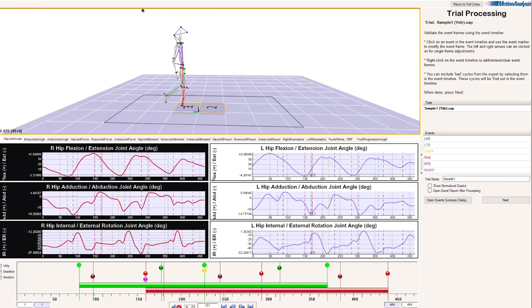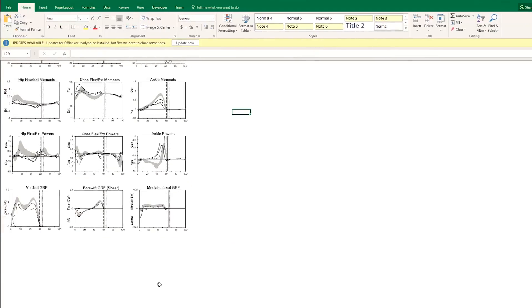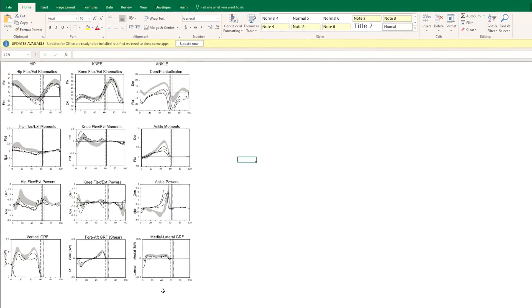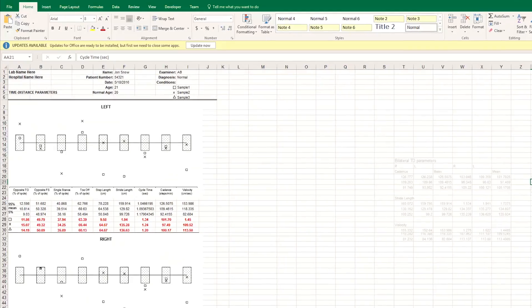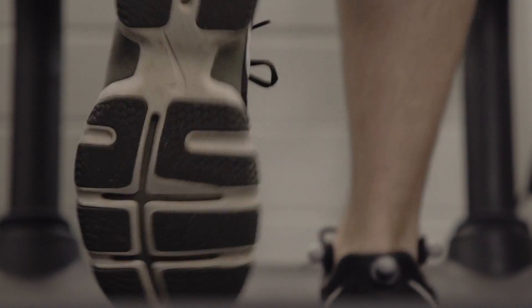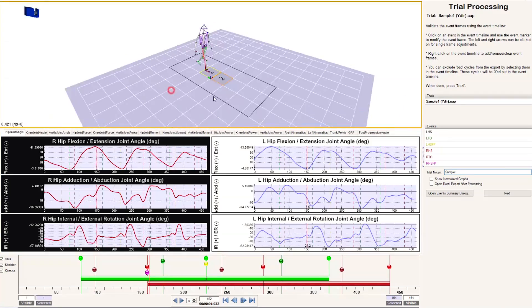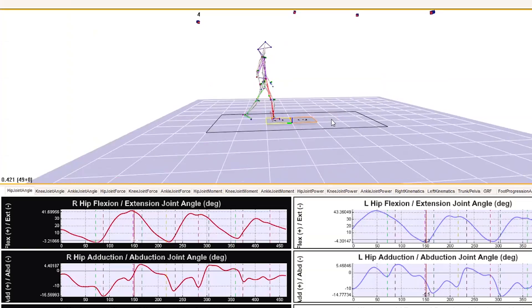GaitTrack was designed with that user in mind, so they can take motion capture data and generate a report that outlines the kinematics, the kinetics, and time-distance parameters of that person walking.